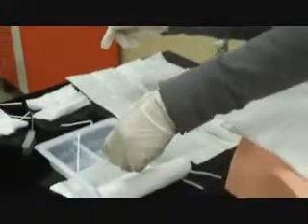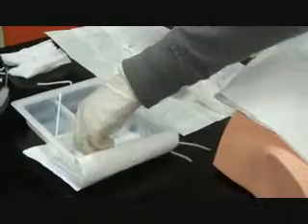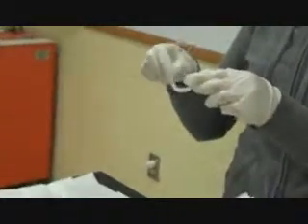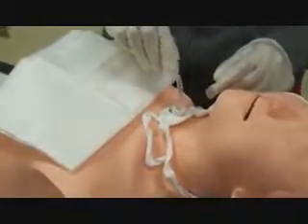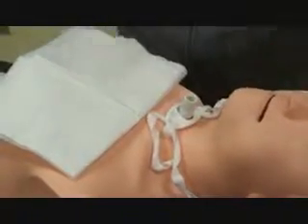Then you will rinse it in sterile water. And with your second pipe cleaner, you can dry out the inner cannula to make sure that it is dry. And you replace the inner cannula back into the patient's stoma, stabilize it, and lock it.